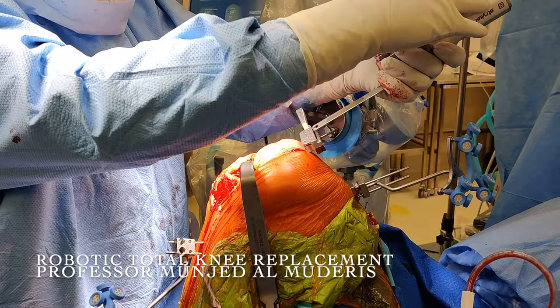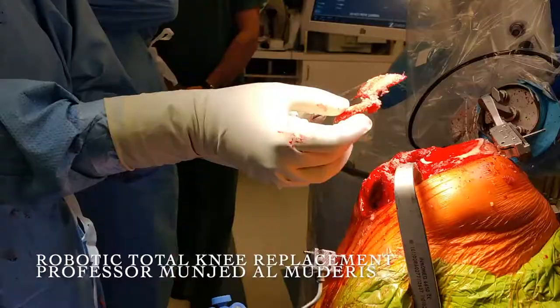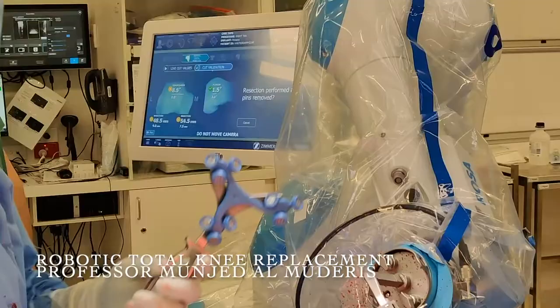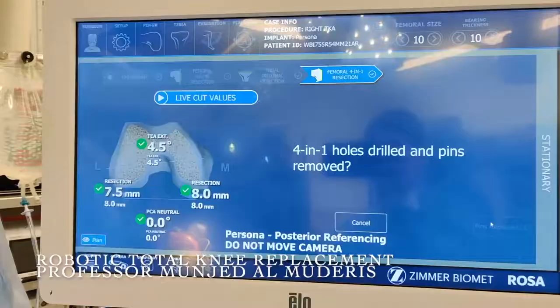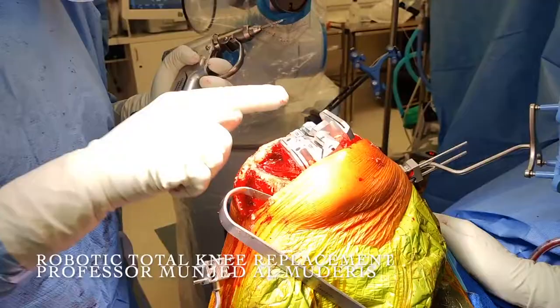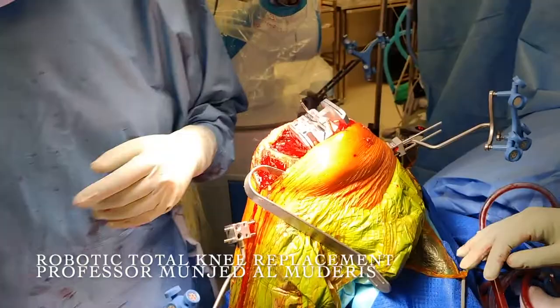Once the tibial resection is complete, we move to the femoral resection. The femoral resection is exactly as planned: 9mm on the lateral side and 7mm on the medial side. We validate the resection with the computer, which has already determined the implant size. The final step is to position the pins for the 4-in-1 cutting block. The block is positioned accurately on the femur and secured with two oblique pins, and we perform the final cuts.